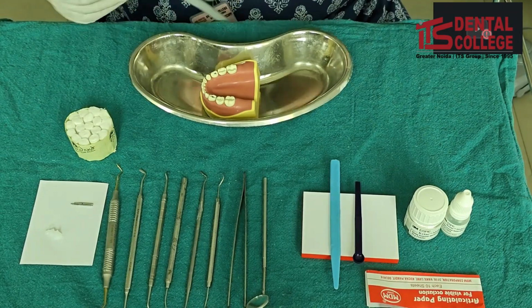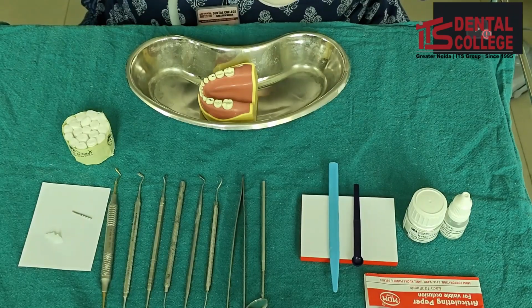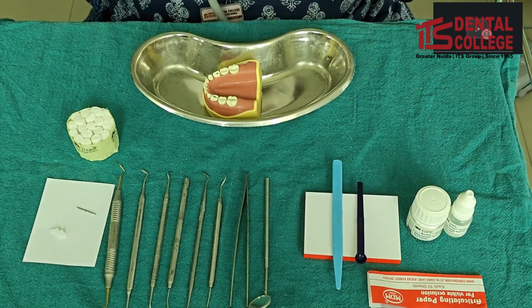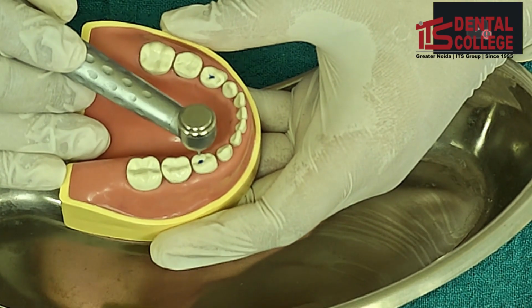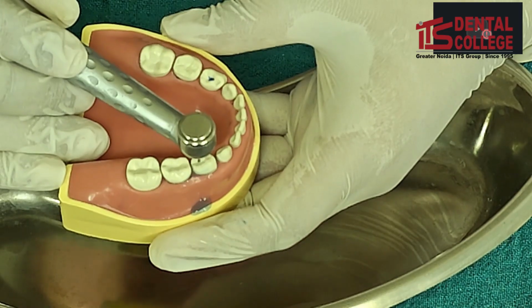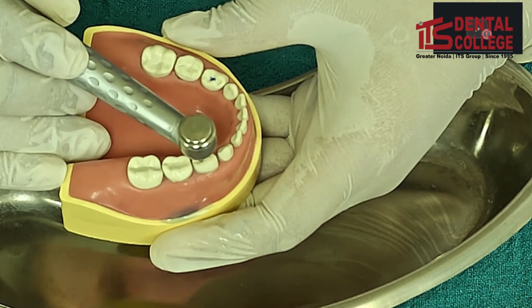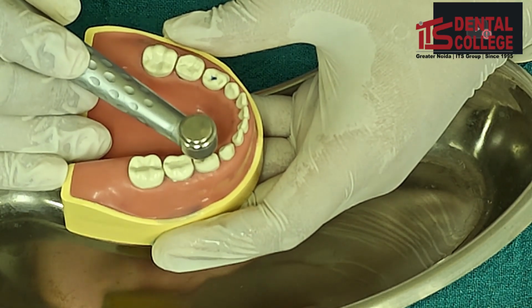I will be using a round burr for making the initial depth of the cavity. I am using a round burr to enter into the cavity and create an initial ditch.